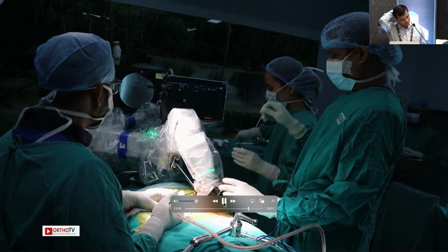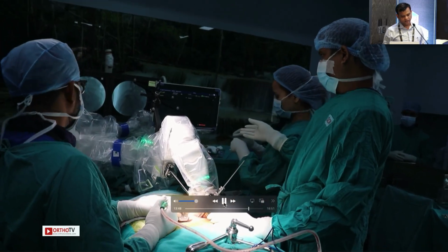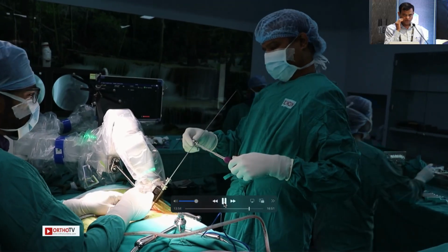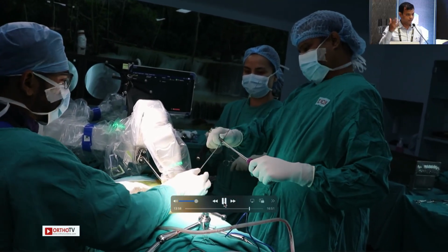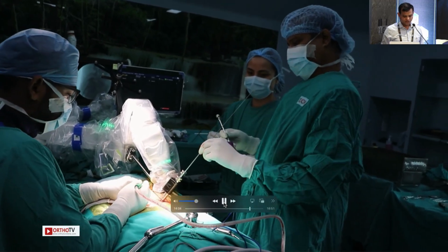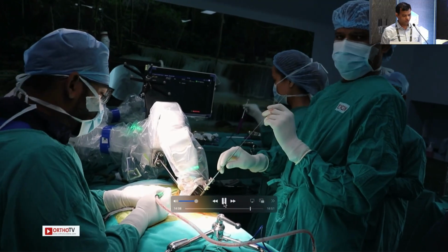And that's the guide for the guide wire. Just put in guide wires. You can use a guide wireless technique also, but then you will have to use the navigable Medtronic screws for that. Then it becomes one of the restrictions. So here with guide wire, we can use any screws you want. You just put in your guide wires.